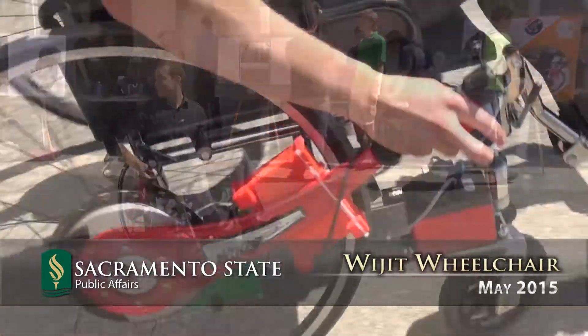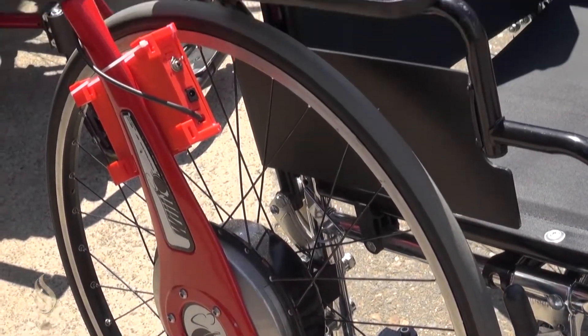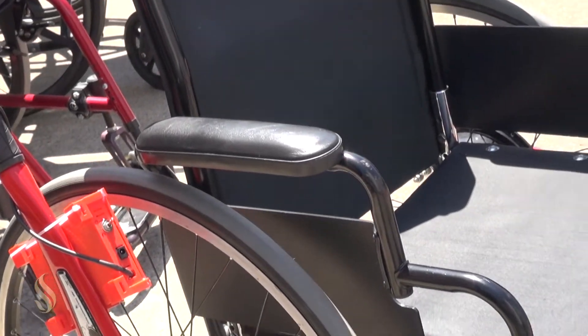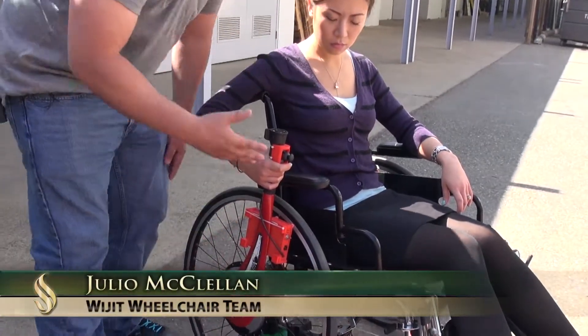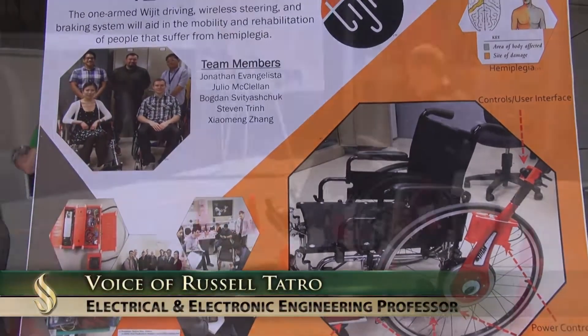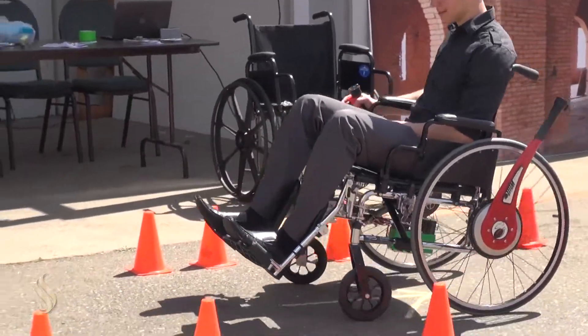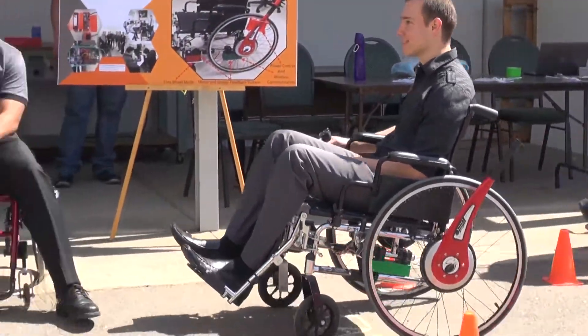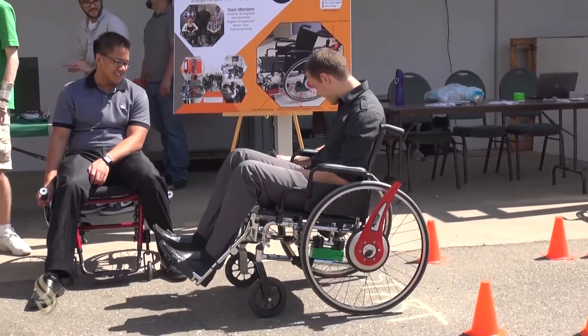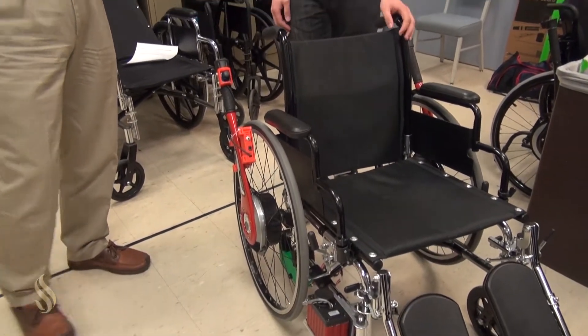The Wijit wheelchair system, which is this entire unit you see here, is normally a two-arm system. We're trying to incorporate electronics and mechanical design so that a person who only has the use of one arm can still use this wheelchair design. Engineering and electronic engineering students spend an entire 10-month period during their senior year looking at a contemporary issue — something that society has deemed an important problem. One of the examples is the Wijit wheelchair, and Bogdan will describe what it's all about.